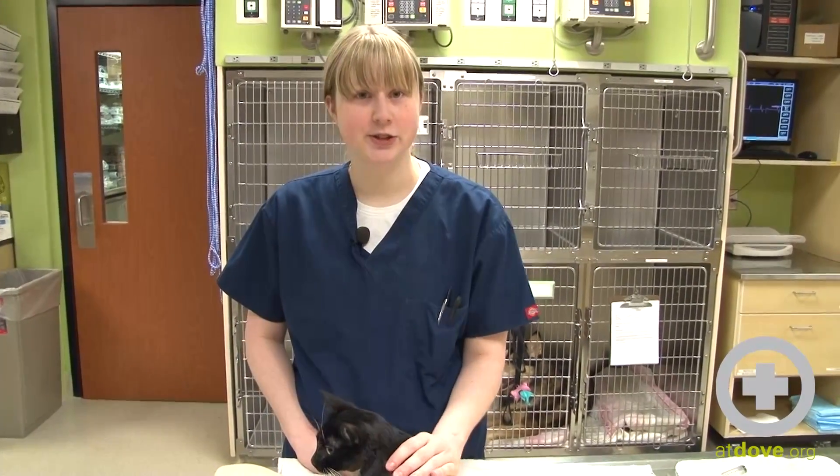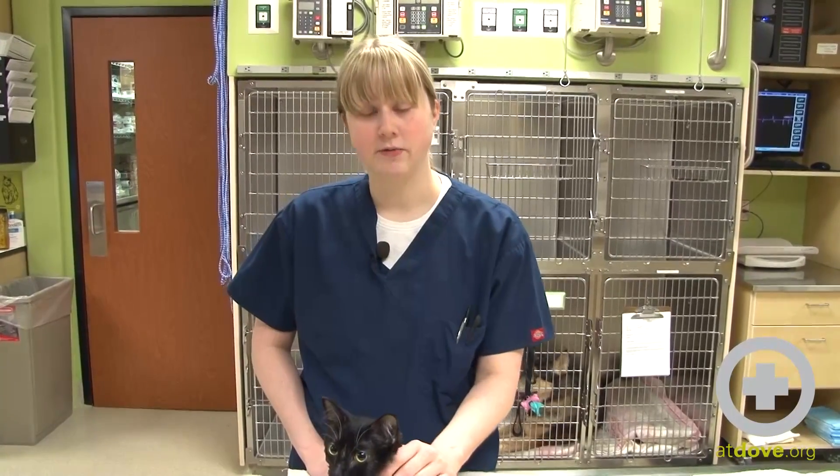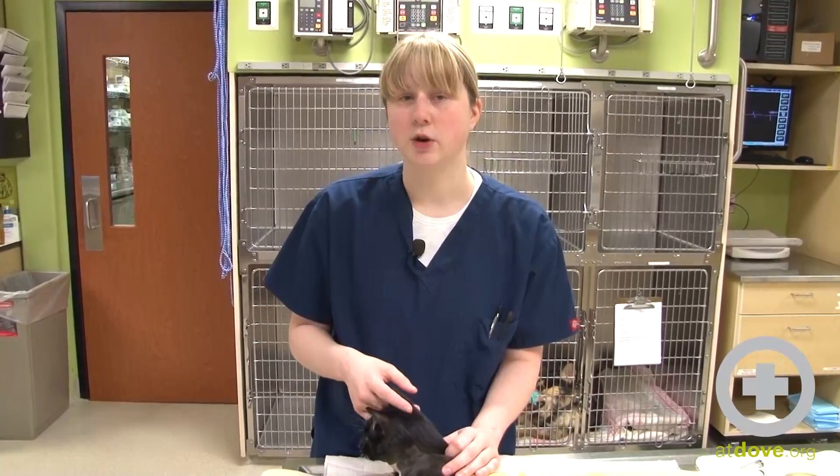Hi, I'm Rachel, one of the ICU technicians, and today I'm going to go over feeding through a PEG tube and also the care and maintenance of one. It's a tube that is placed through the skin directly into the stomach with the help of an endoscope.